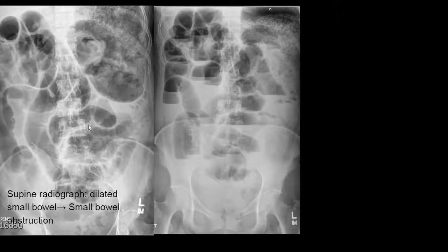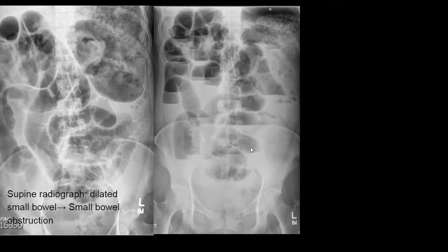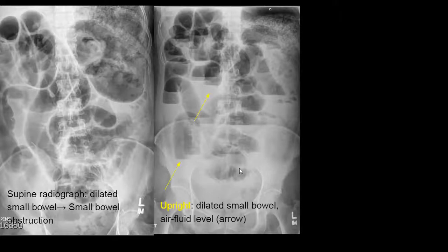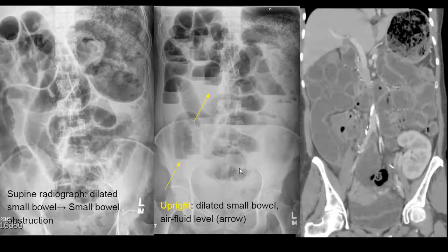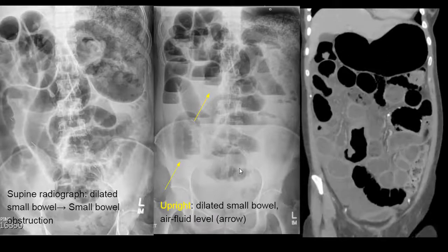This is a patient who is supine, but when the patient stands up we can see air-fluid levels, and this is what we typically see with small bowel obstruction. Because there's an obstruction distally, the normal air and fluid is not able to pass, so you get buildup and proximal upstream distension.